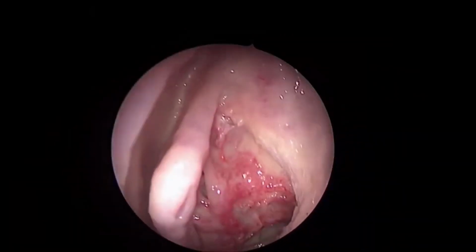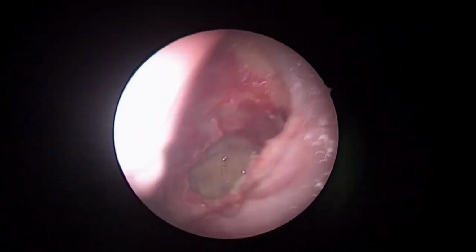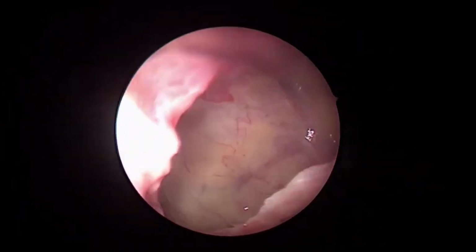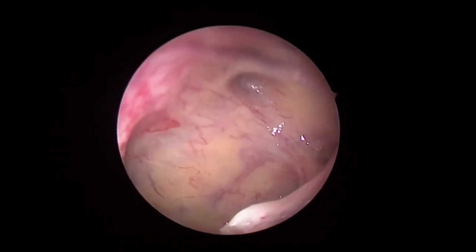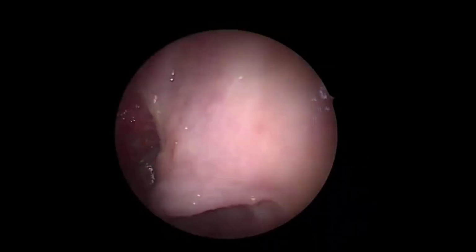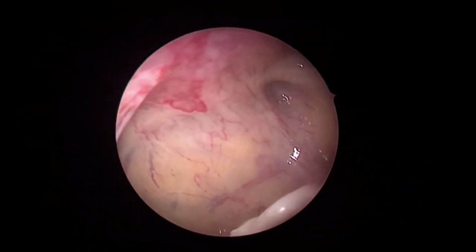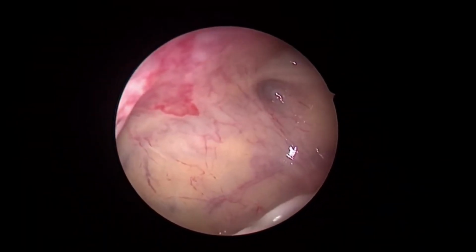Okay. So now, with the 70 degree, let us first orient you. This is the middle meatal antrostomy you saw. And if I go inside and rotate, you see the interior of the maxillary sinus. And what I can show you, what is it now? See the prominence in the roof. Can you see that neurovascular bundle?